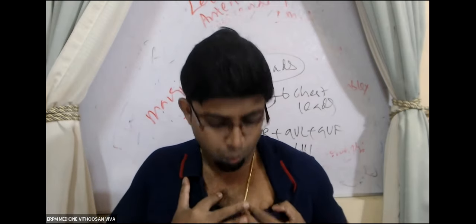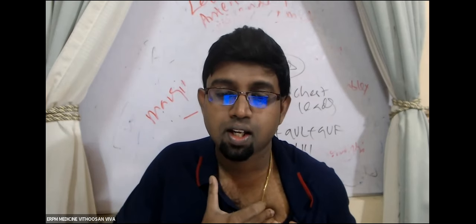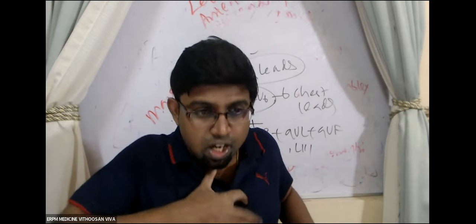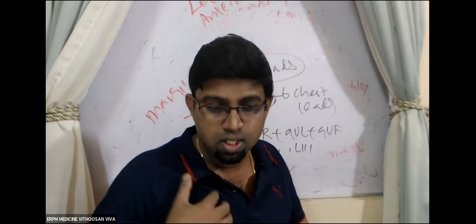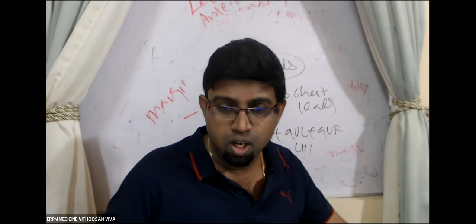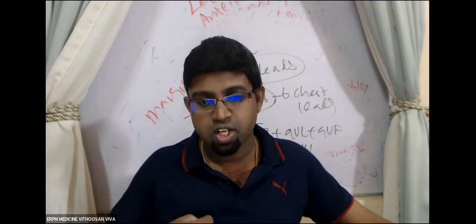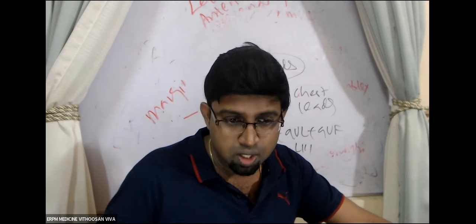So what is the intercostal space immediately lateral to the sternal angle? Second intercostal space. Then third, fourth, you can count. So you count there and put on the right side, just lateral to the sternum, V1. You put on the left side, just lateral to the sternum, V2.